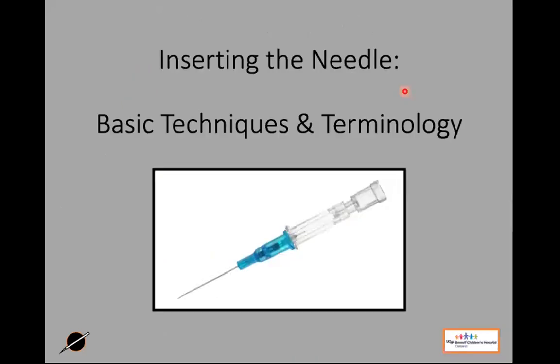Okay, now everything's set up. One question. Do you recommend putting a tourniquet on while you're looking? Yes. Put the tourniquet on. You want those blood vessels nice and big and plump. We kind of want to know what our target is. And now we can always take it off, get everything ready to go, clean everything up before we actually do our needle insertion. But when we're looking for that vessel, put that tourniquet on. Good point. I should have mentioned that.